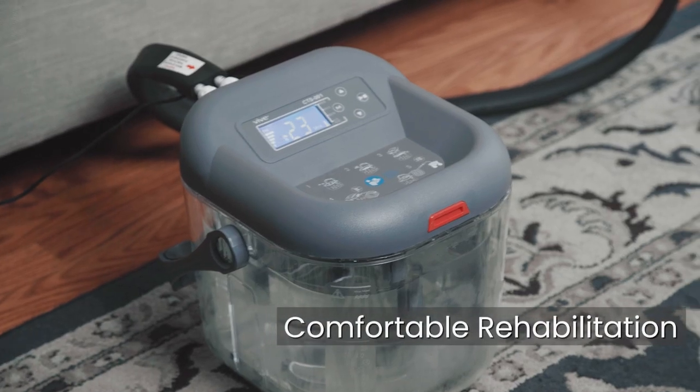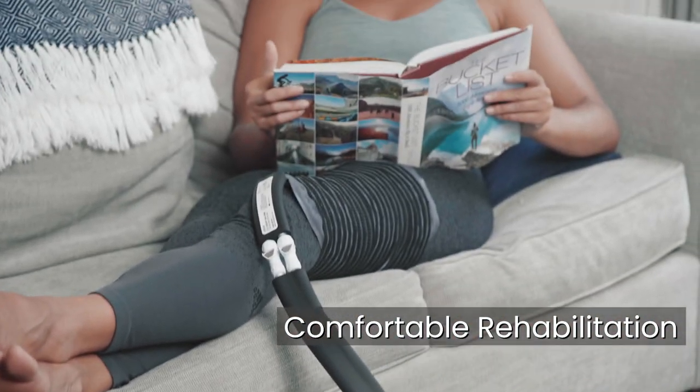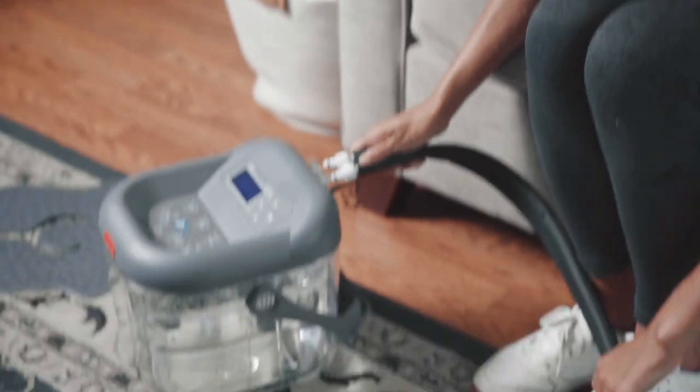The extra-long insulated tubing allows for comfortable rehabilitation at home and ensures that the water temperature remains constant throughout your treatment.